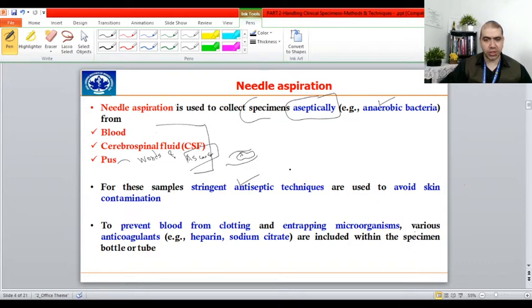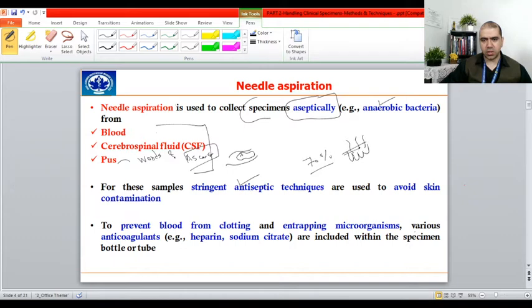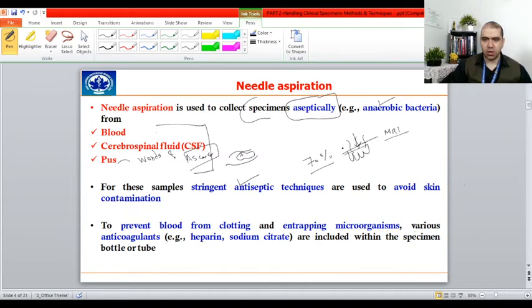You must clean the area of the patient where you are collecting the sample, using ethanol swabs or 70% ethanol on cotton to wipe the area. Blood can be collected from the arm veins or, if veins are not visible, from the veins running on the upper hand. When a patient needs an MRI or cancer detection, needles are often placed on the upper side of the hand where veins are more visible.